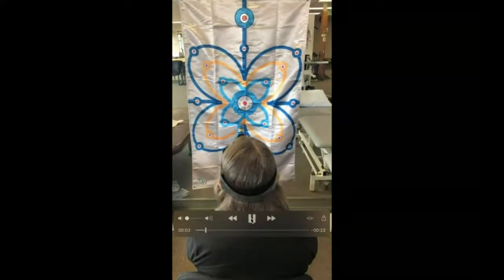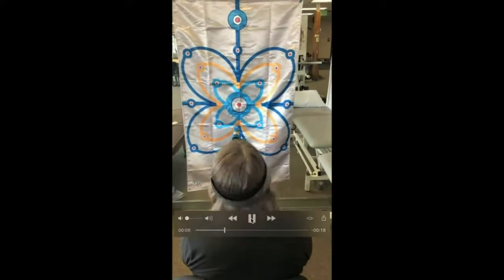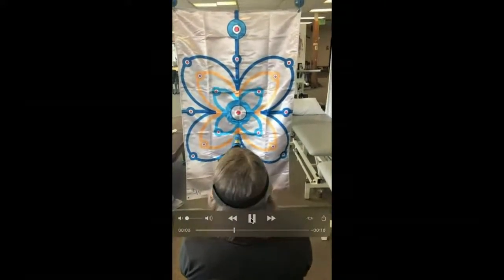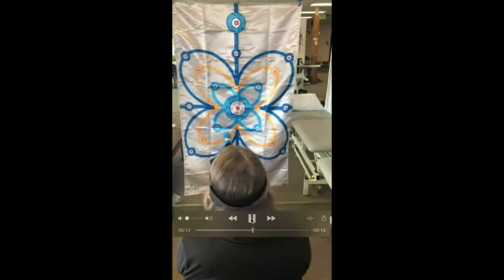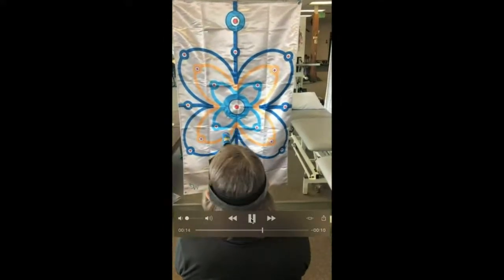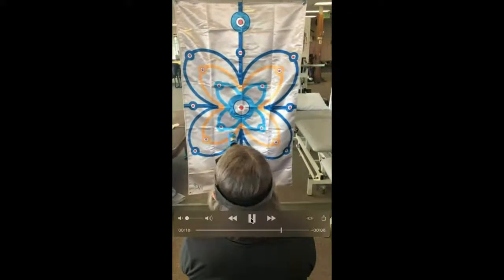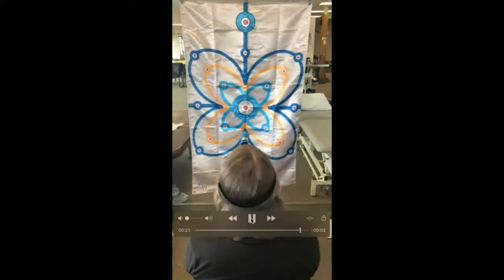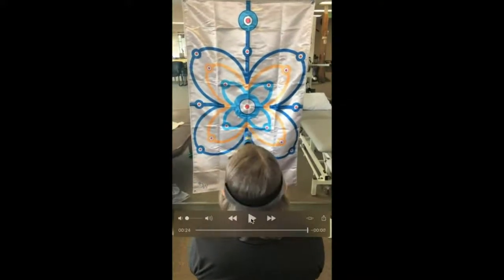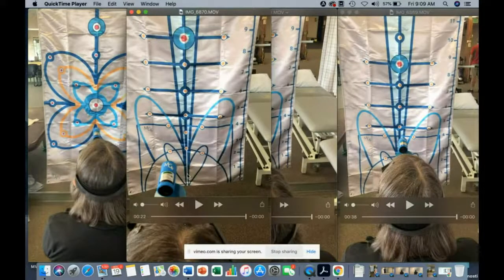And so if this is my initial assessment, I'm going to say, well, we definitely have some issues there that I want to try to have her focus on. No pun intended. So I'm going to have her try to understand, after showing her the video, that she really likes to be to the left and use that right dominant eye. She doesn't like to go to the right and use the left eye for her VOR. So we're going to try to correct that with some of these assessment and training tools.